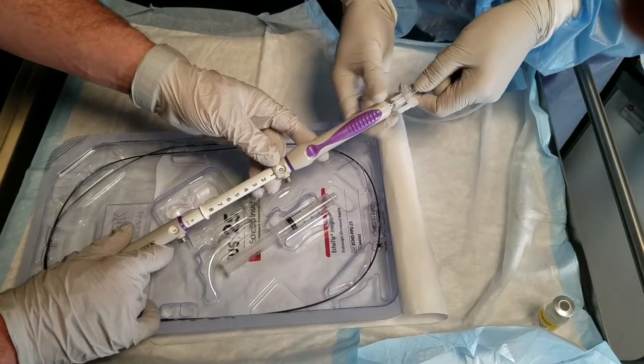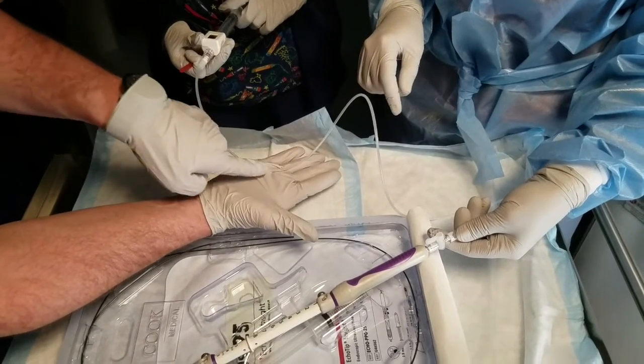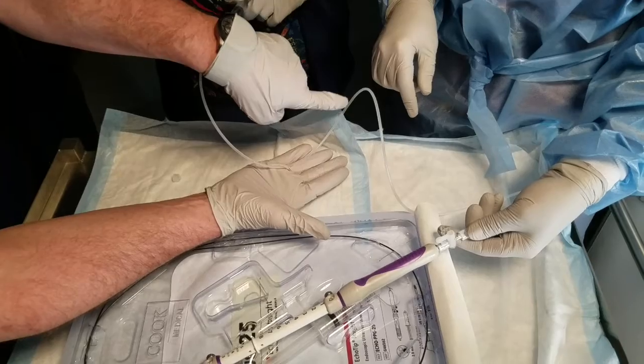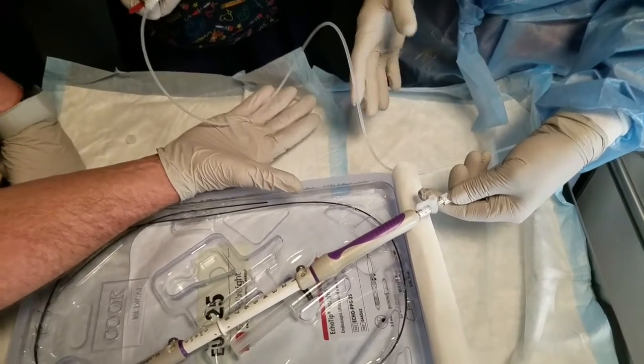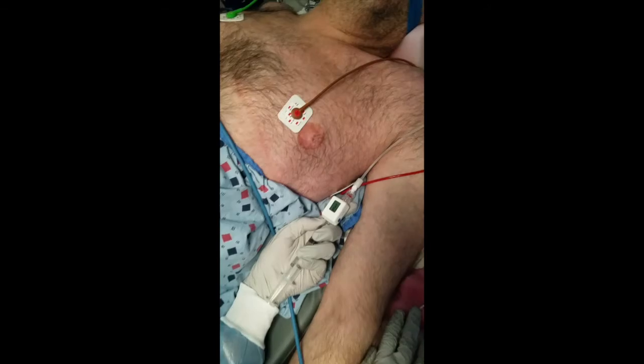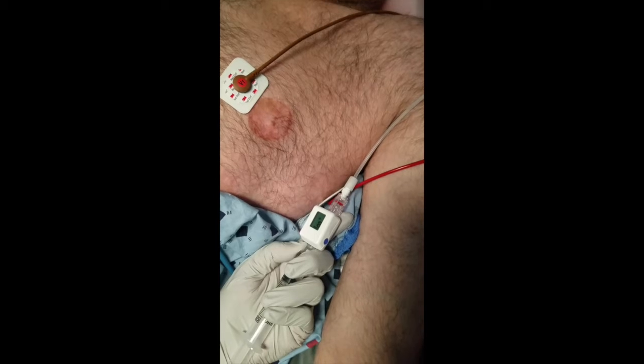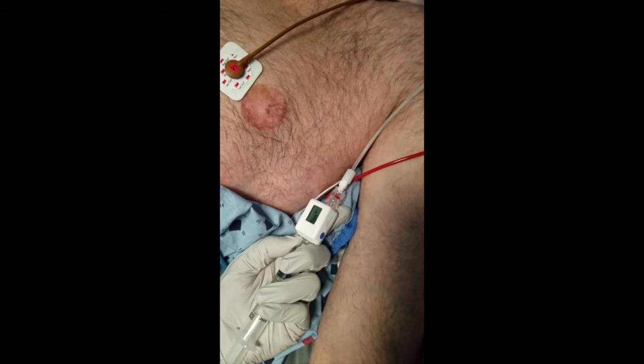The ECHOTIP Insight Portosystemic Pressure Gradient Measurement System by Cook Medical was then set up. This involved connecting a 25-gauge fine needle aspiration needle to non-compressible tubing connected to a compact digital manometer. The entire system was flushed with heparinized saline. The needle was introduced through the echoendoscope channel and secured, while the manometer was placed at the patient's mid-axillary line.